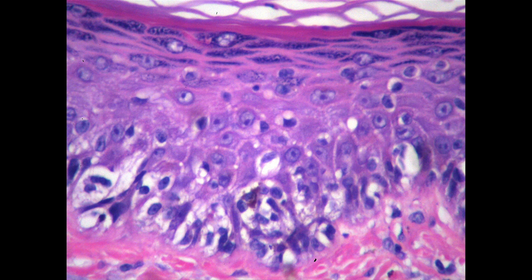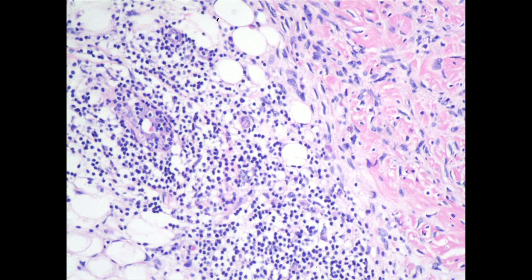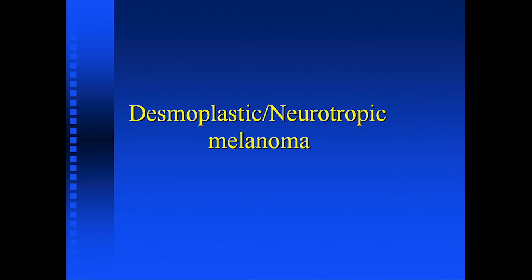You'd be very inclined to say this doesn't look so bad, but then you look at a telltale clue. You look at the epidermis overlying it, and there are solitary melanocytes proliferating — not much atypia, just like an atypical junctional proliferation. Also in another area of the slide are characteristic lymphoid aggregates, which probably represent a type of immune response to this tumor.